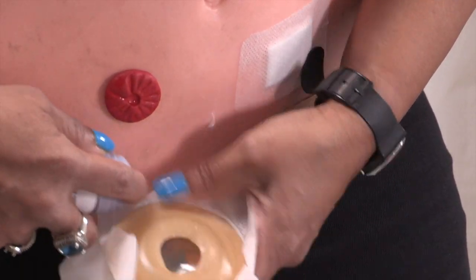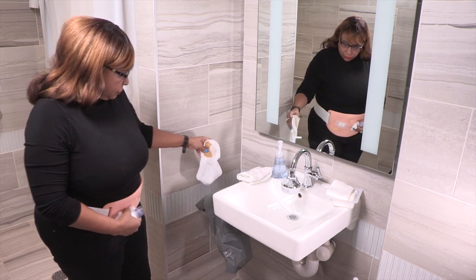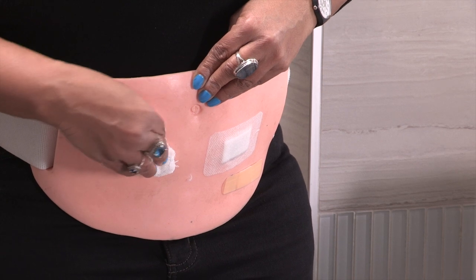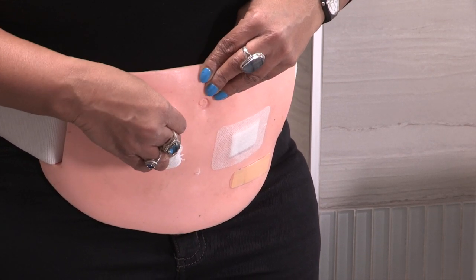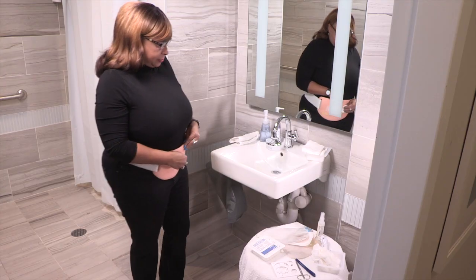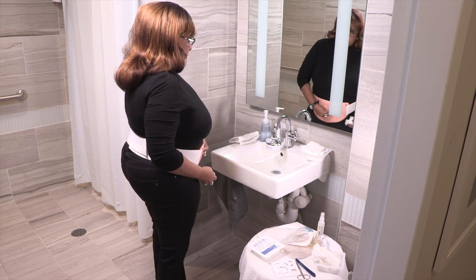Once you've removed the pouching system, throw it in the trash. Hold a dry piece of gauze, paper towel, or washcloth over the opening of your stoma to keep urine from leaking out. Change it if it gets soaked with urine. If you're removing your pouching system in the shower, you don't need to do this — the urine will flow down the shower drain.